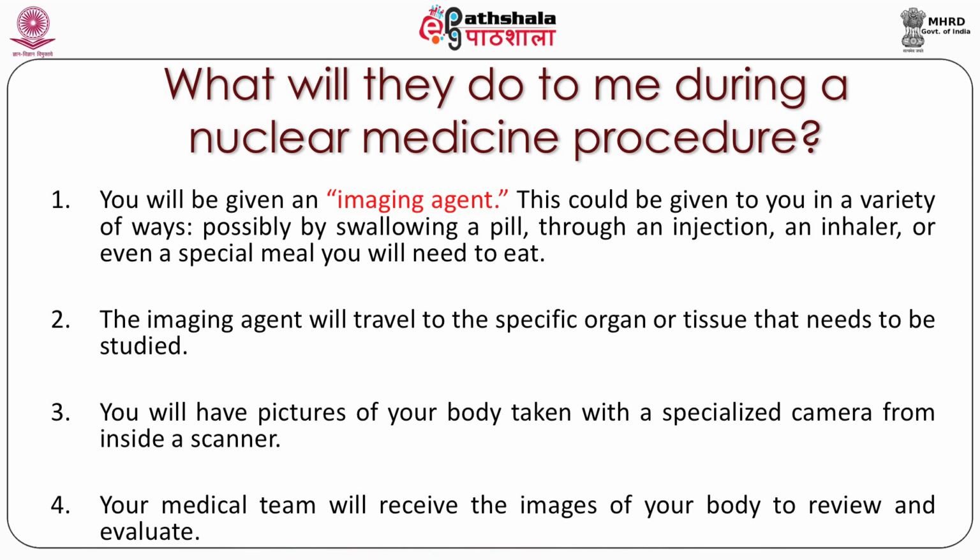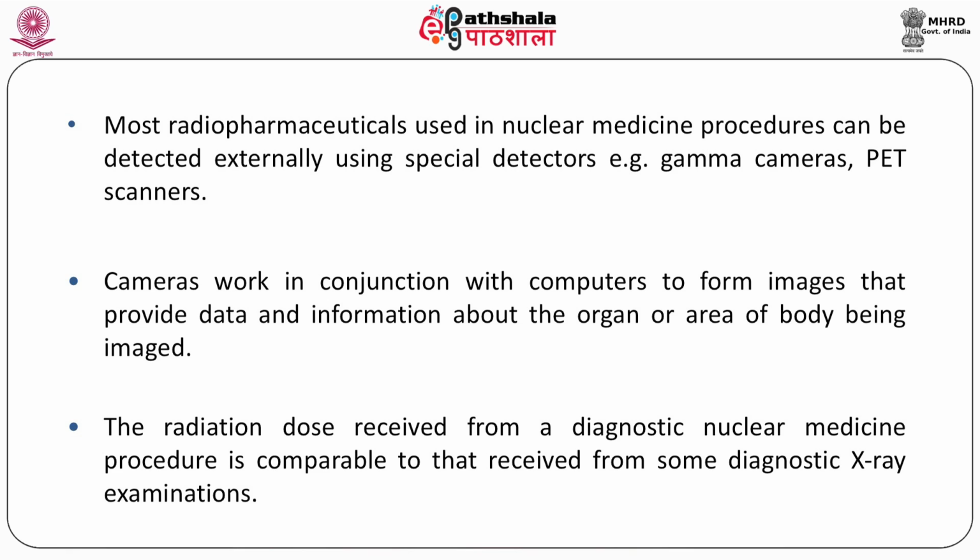When we take any kind of drug, here we don't call it a drug, we call it a radiopharmaceutical. It goes into the body through different mechanisms. Radiations are emitted from the organ which we want to diagnose, and after detection by these special devices, images are created, and these images are utilized by the doctors to design or formulate the treatment regime. Most radiopharmaceuticals used in nuclear medicine procedures can be detected externally using special detectors.